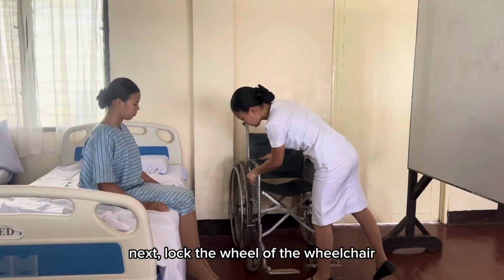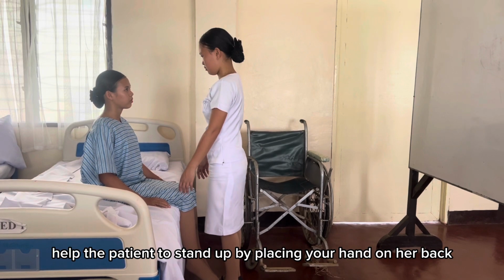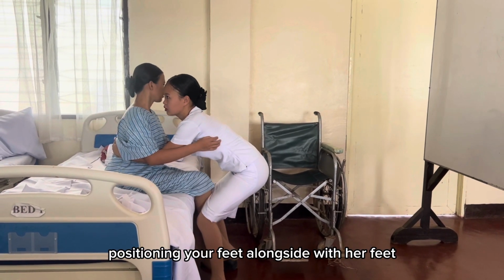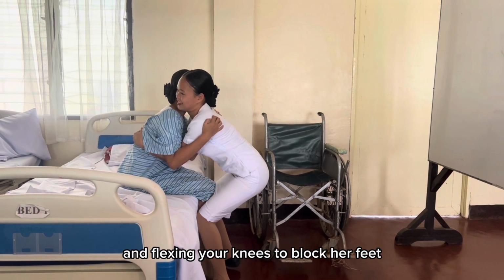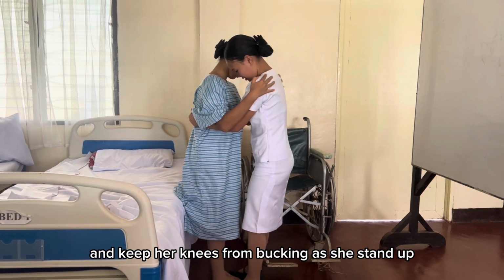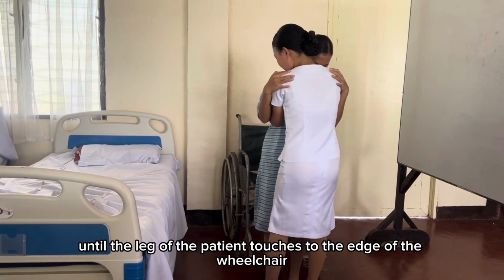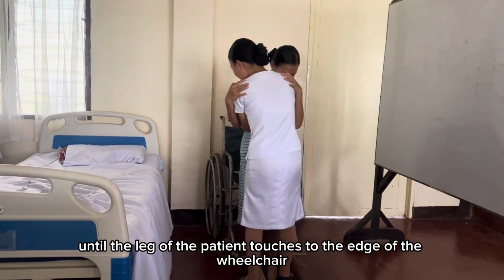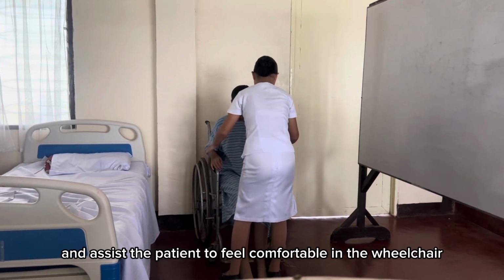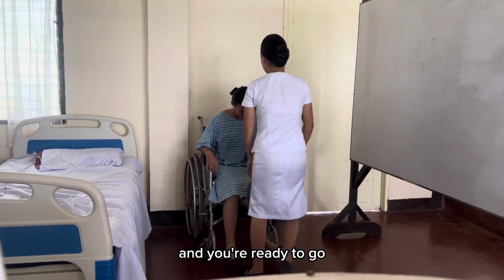Next, lock the wheels of the wheelchair and position the footrest out of the way. Help the patient to stand up by placing your hand on her back, positioning your feet alongside her feet, and flexing your knees to block her feet and keep her knees from buckling as she stands up. Remain in that position while walking until the legs of the patient touch the edge of the wheelchair. And assess that the patient feels comfortable in the wheelchair and you're ready to go.